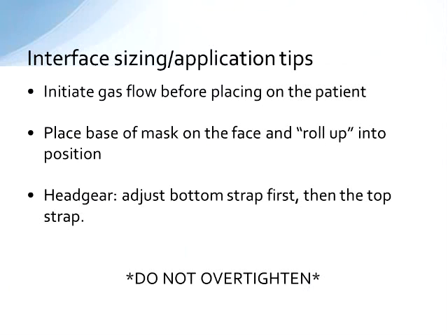This slide is really important for our nurses to know as well. If the patient's popping off and having lunch or talking to grandma or having ice chips, they need to know how to put that mask back on appropriately. And we also need to spend a little bit of time with mommy and daddy teaching them the same techniques as they engage with their child, so they're not inadvertently putting their kiddo at risk for skin breakdown.